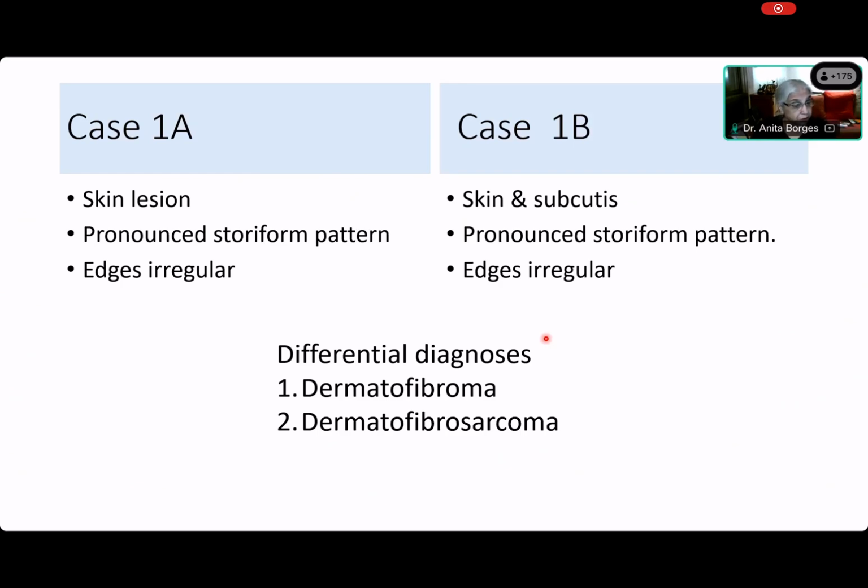All right. What about Priyamada? What is your diagnosis? Ma'am, dermatofibroma, but I also thought of deep fibrous histiocytoma. Deep fibrous histiocytoma. For what? On 1B or 1A? 1A. Ma'am, and 1B I thought of perineurioma. Perineurioma. Oh, okay. Aditi? Oh, she's not there. Maybe. Diksha? I asked you. Fibroma. Oh, dermatofibroma. Which one?